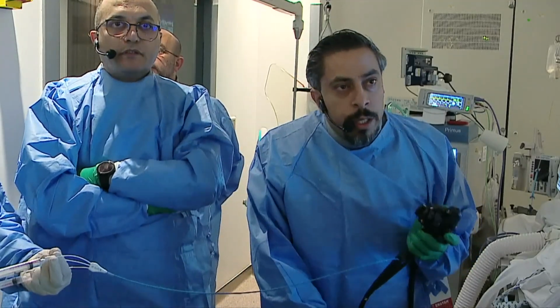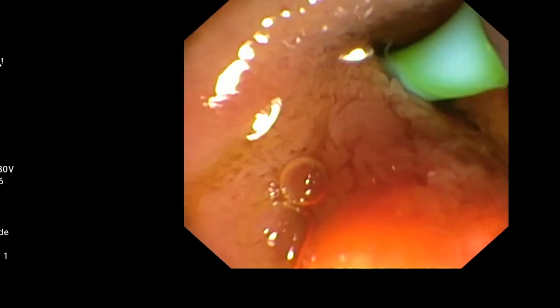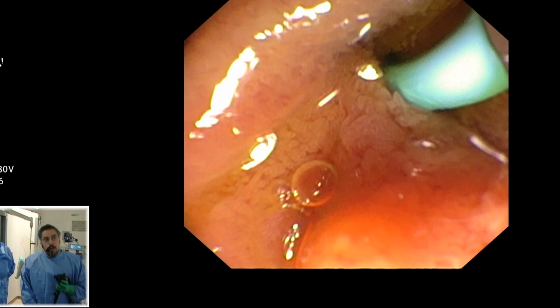Dr. Albsher, can you hear us? Yeah, we hear you. Do you hear us? Yes, so you are live. You have the case with the CBD stone.